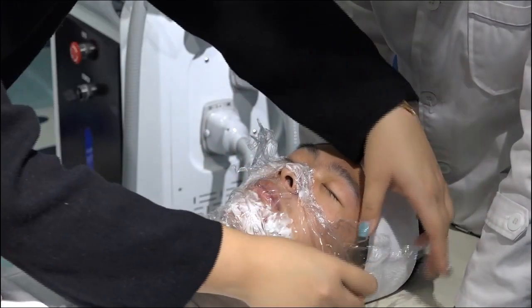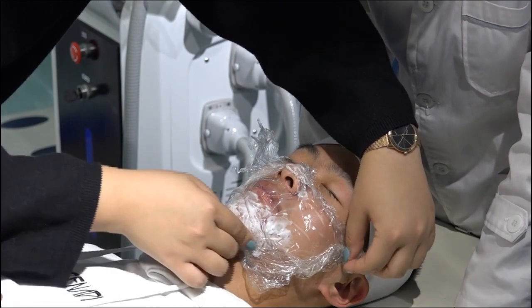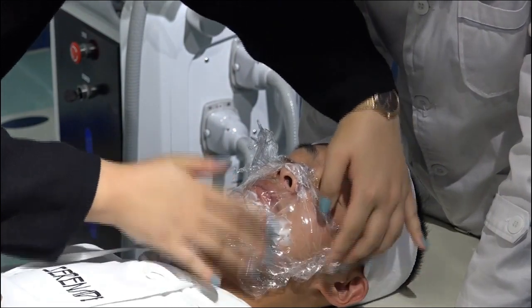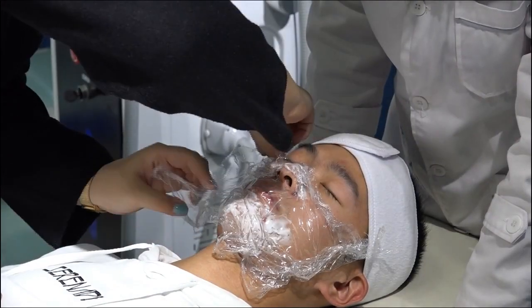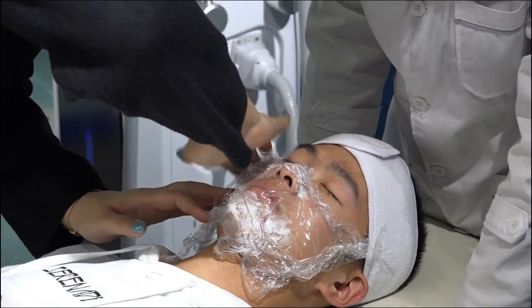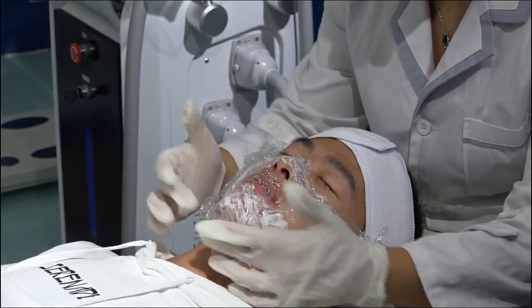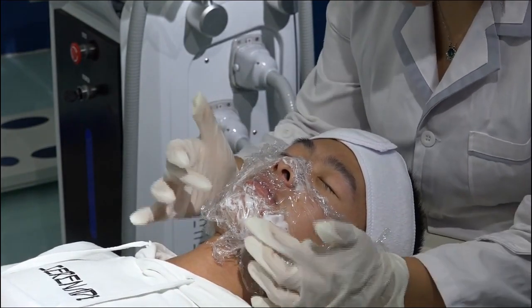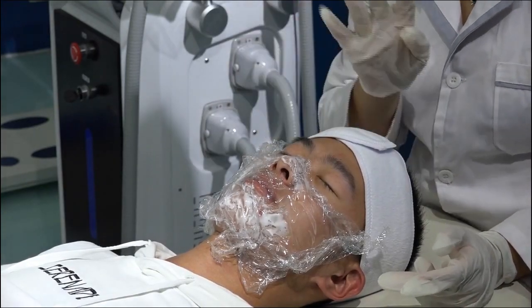Okay, we cover with a plastic wrap and let the numb cream work, normally 30 to 40 minutes.